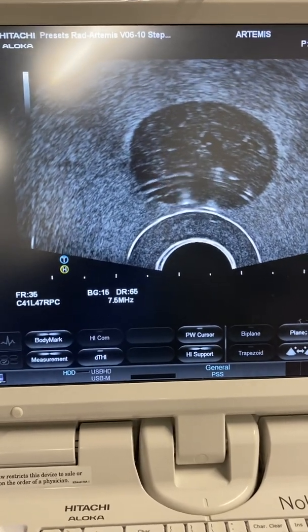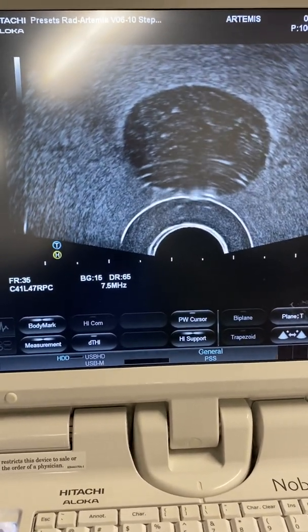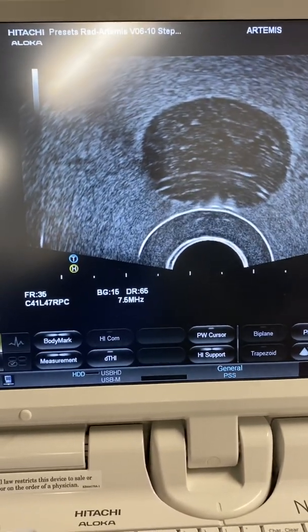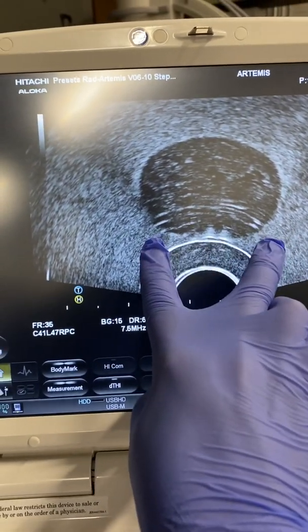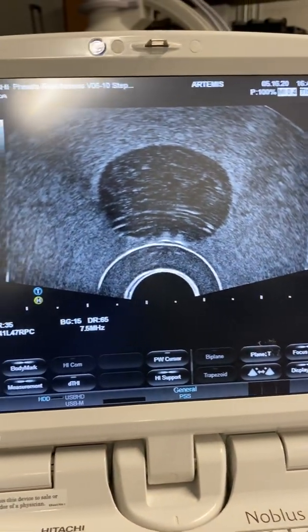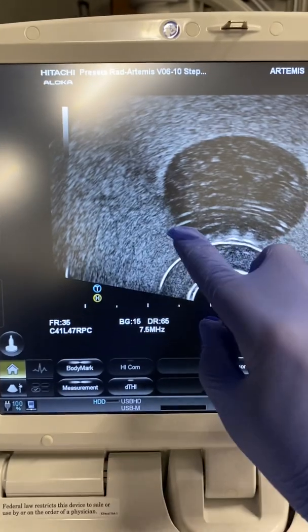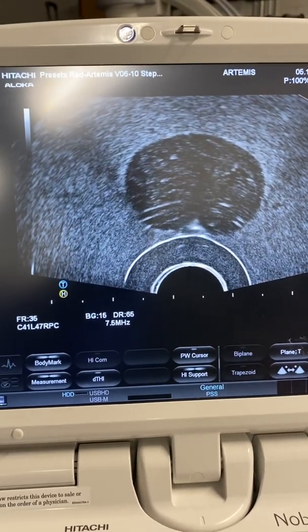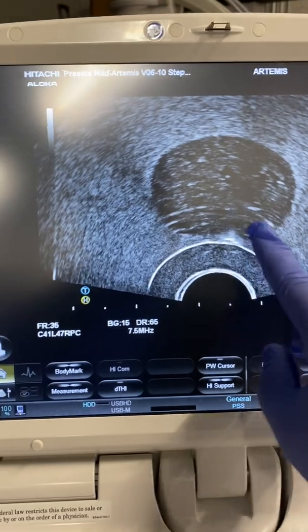They're going to move the needle and see if they're pulling the prostate. If they are, they can pull back and go down into the space. If they're in the rectum, they can pull back and go up into that space. Then they'll hook up a syringe of saline and inject some saline - you'll see black fluid flowing in this area. They look to see if it goes equidistantly and separates the area enough. If it only goes to one side, they may have you decompress the gland more, or they may shift the needle slightly toward the side it's not spreading to.